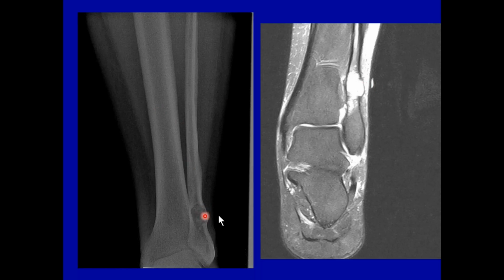This was great, but we didn't know which was left and right. And if nothing else from this section, please take away all x-rays of the extremities need to be marked. So the buzzword that you want to take away from this section is the word extremity.